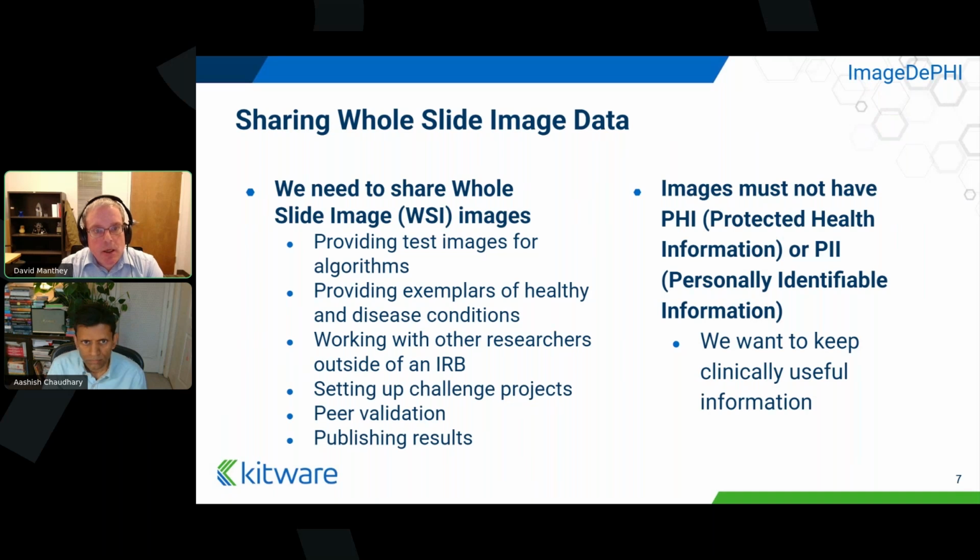But in any case, in general, you have these whole slide images, and when they come from human subjects, we have to de-identify them. So in order to do this, in order to share data so we can use it, we have to remove protected health information and personally identifiable information.